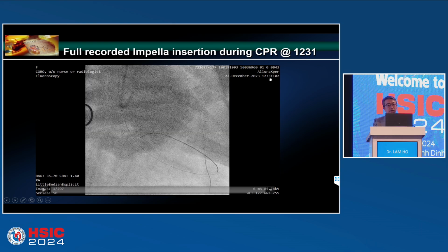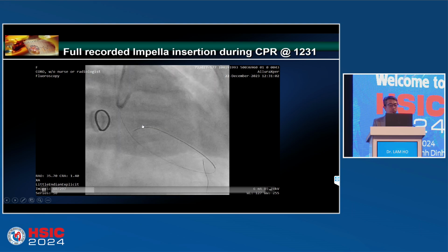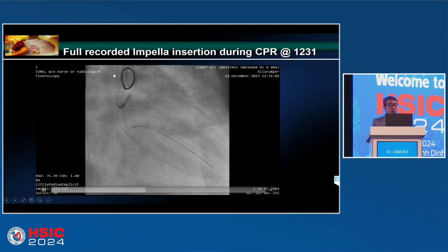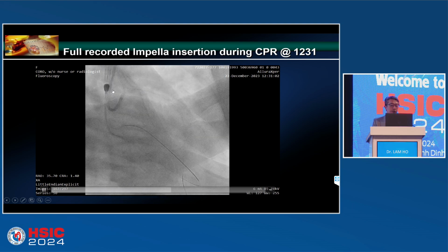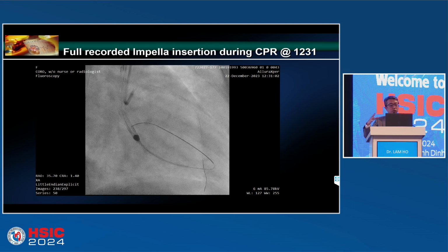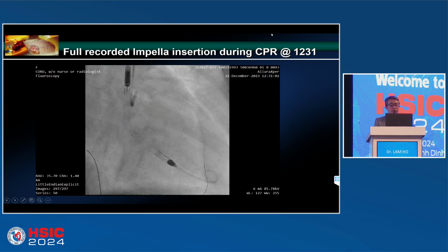And then 60 seconds later, you can see. Continue to press the heart. Make sure the patient doesn't have hypoxic brain injury. When the Impella goes into the aortic area, sometimes you will have some resistance, sometimes not. It's because the aortic valve will close while the patient's heart does not beat. So you just press the heart, open the aortic valve so that you can push the Impella in. So just 60 seconds, we put the Impella in. 60 seconds, 1 minute. And then start the Impella.